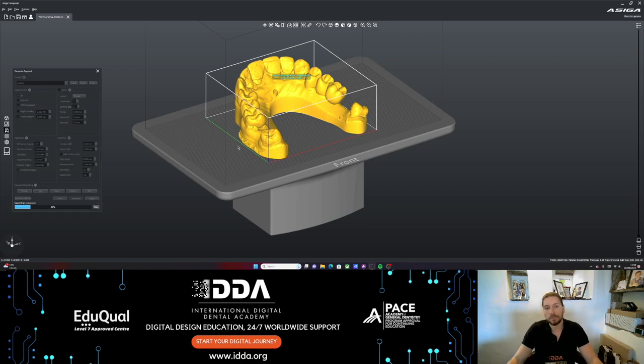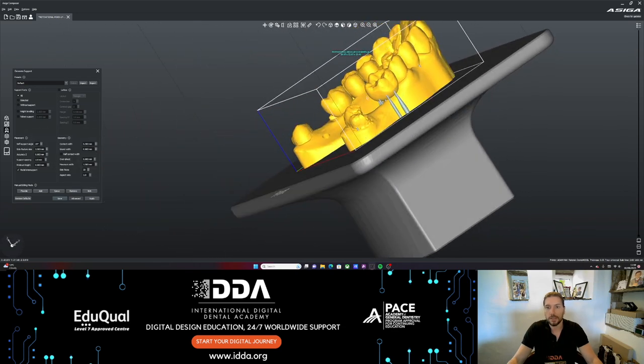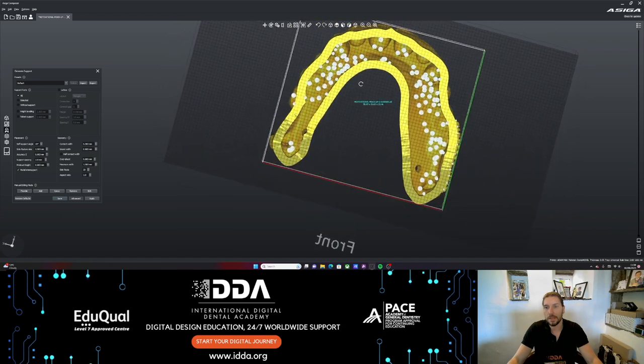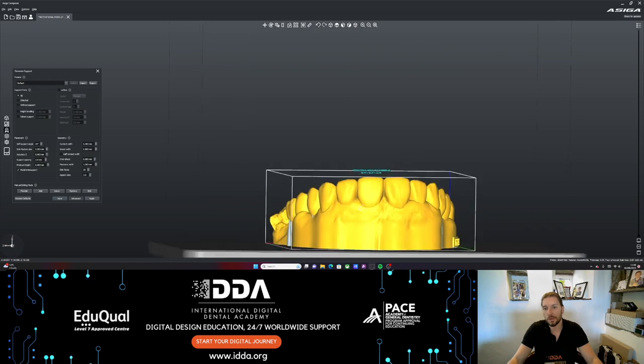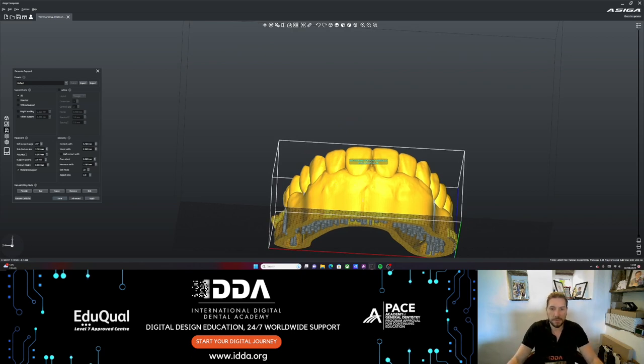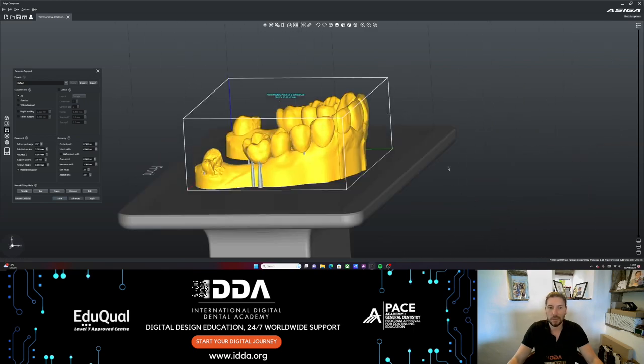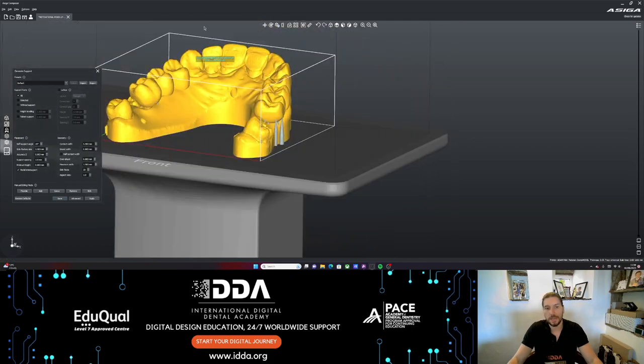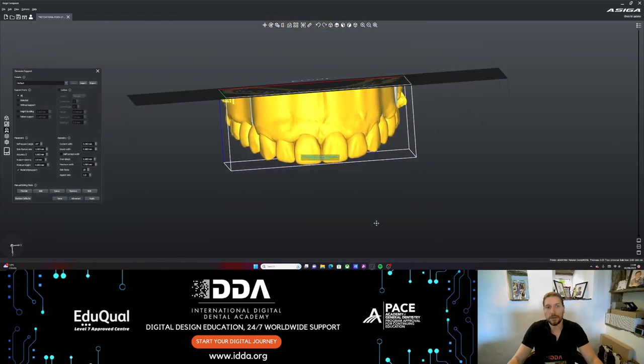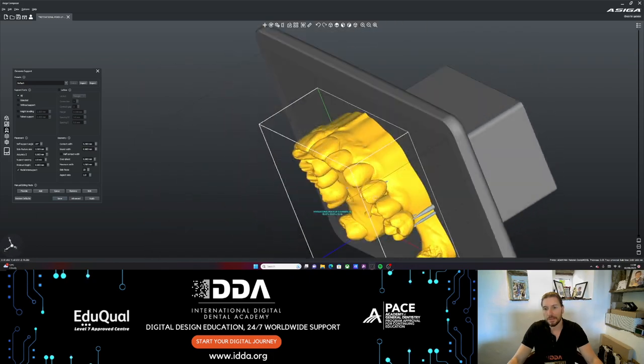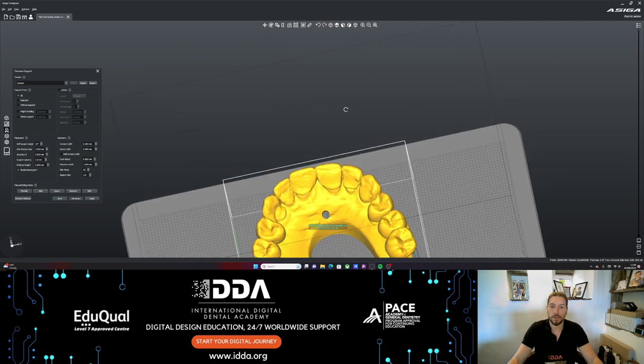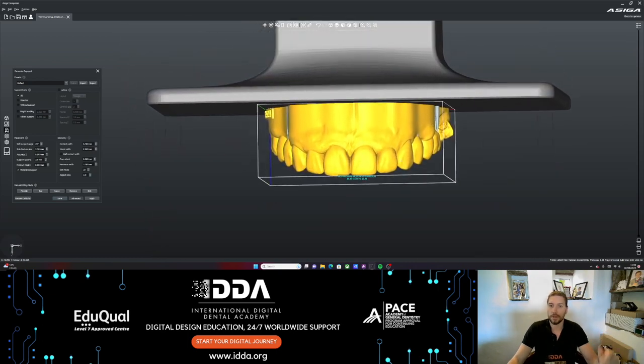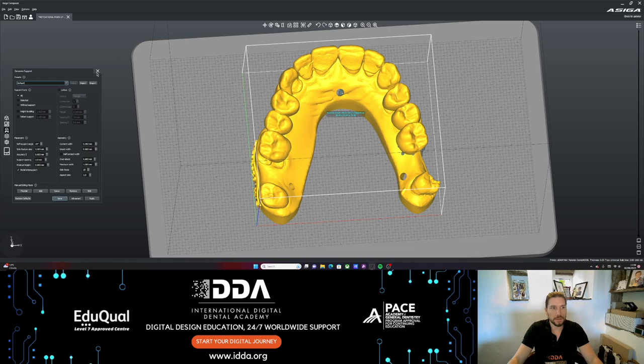Then it will create those supports without lifting the model off the platform, making sure that everything as we're printing it is going to be printing appropriately. We might not need things like that, but you can select where to have internal supports. My preference is to add them anyway just in case, because what you don't want if you've printed something like this is for the inside to just not be supported well and you get a little bit of collapse. It all comes down to how you've designed your model, the thickness you've done, whether you've added holes for it to drain resin. You can see here the way that these holes have been added here, here, and here. If we're upside down, why is it printed like that? Because if we print them at the sides and it's upside down, the resin is not going to get out there. Whereas if we print these with the holes here, when it's printing that way up, the resin can escape.